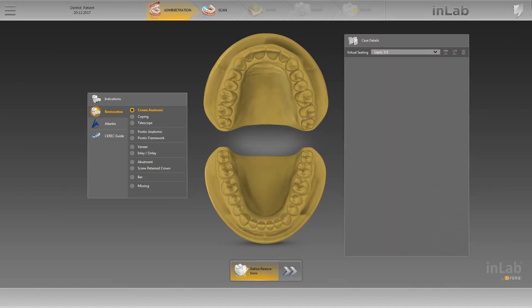When selecting the indication, no distinction is made between bridge and single tooth restoration. Instead, you create the desired restoration directly in the odontogram, and define the type of indication by setting or removing connectors. We'll keep the crown anatomic pre-selection and click on the position of our single tooth restoration in the odontogram.